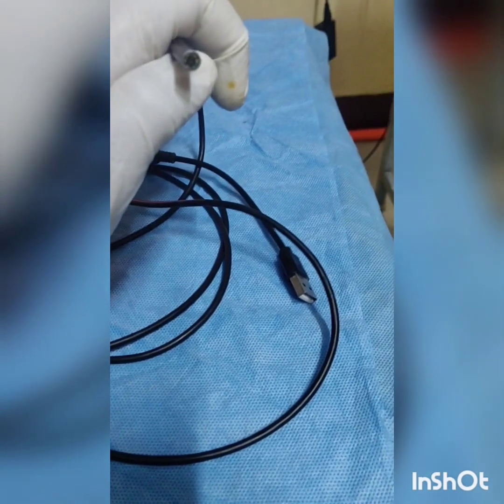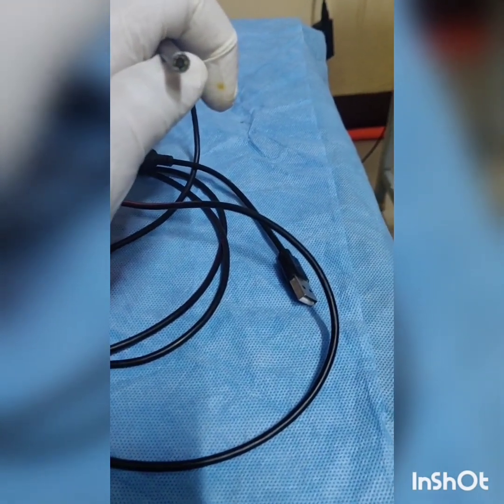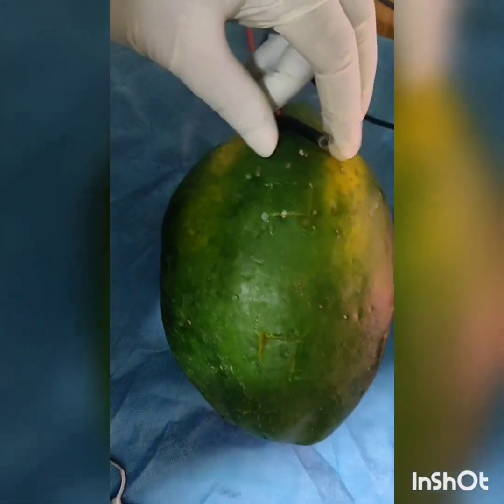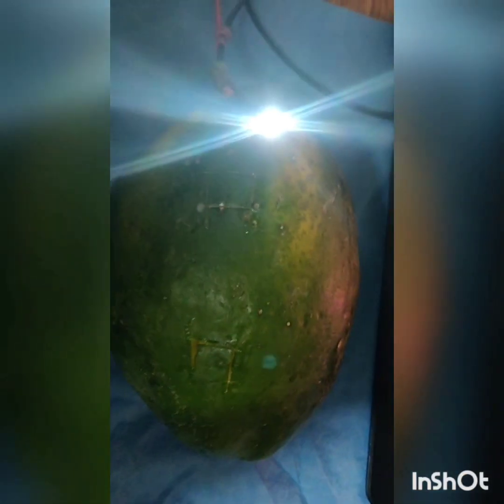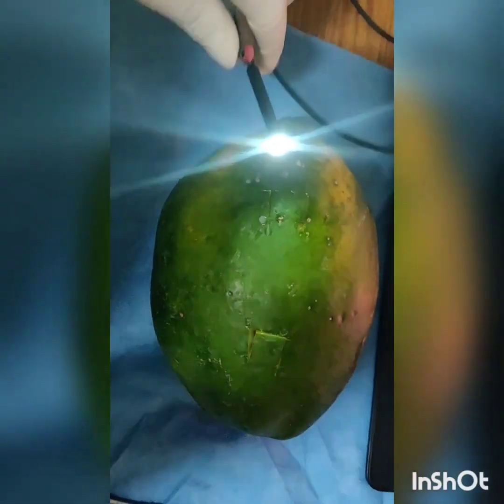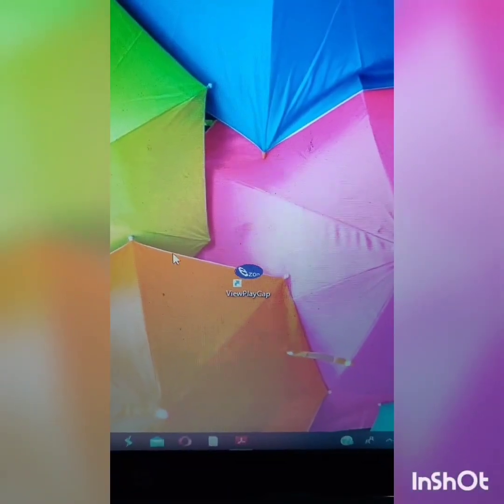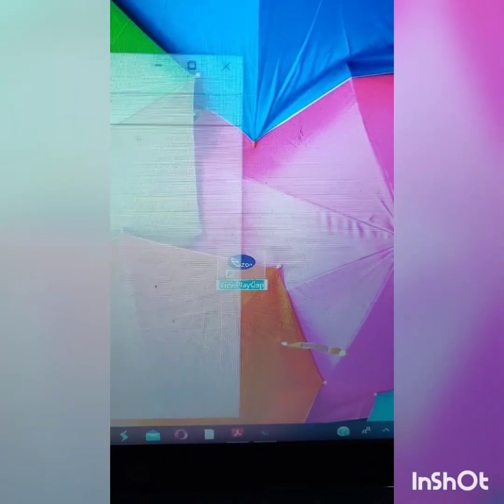This can be attached to a laptop and run through a software. We will need a papaya and a long artery. Now I would like to connect this web camera to the laptop. Once connected, we have an illuminating light. I will switch on the software and check for the clarity of the camera on the underlying cloth — the quality appears to be decent.